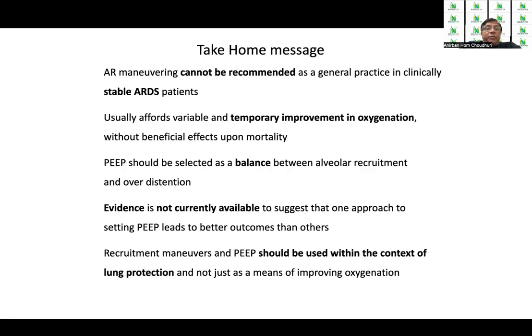So my take-home message would be that alveolar recruitment maneuvers cannot be recommended as a general practice in clinically stable ARDS patients. Usually, it affords variable and temporary improvement in oxygenation without proven beneficial effects upon mortality. PEEP should be selected as a balance between alveolar recruitment and overdistension. Evidence is not currently available to suggest that any one approach to setting PEEP leads to a better outcome than others. And recruitment maneuvers and PEEP should be used within the context of lung protection.